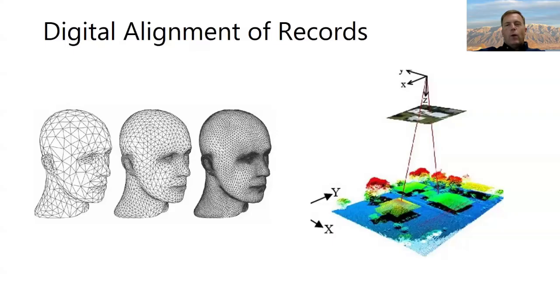The bite scan, though, is quite different. You start taking your bite scan, you see the data, and then all of a sudden, pow, the two arches snap together. That's really important because what the software has done is it's taken common points between the maxilla and the mandible using your bite scan, and now they both have the same common origin point. So if you align the upper scan and you import the lower scan in the same alignment, you can trust that that bite is being preserved.